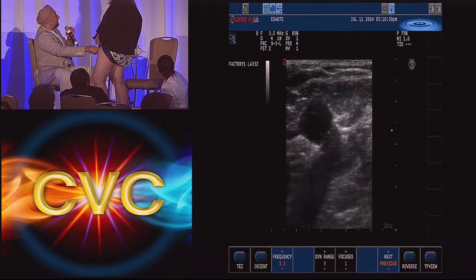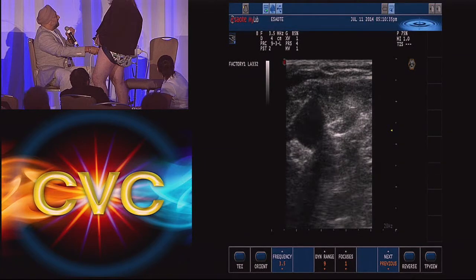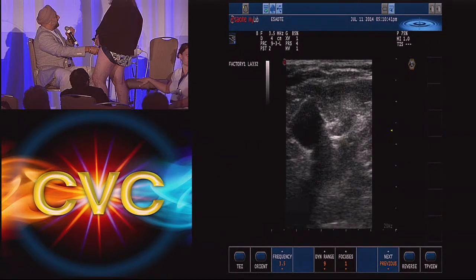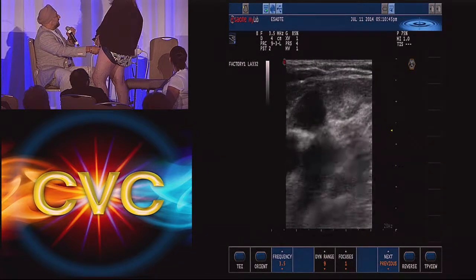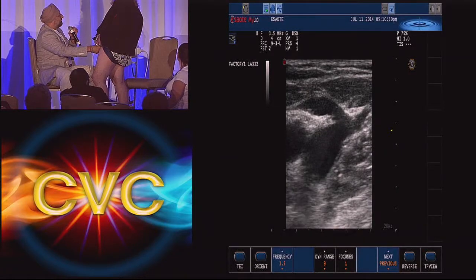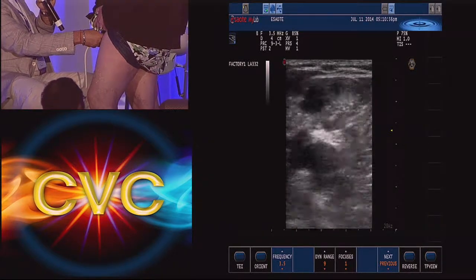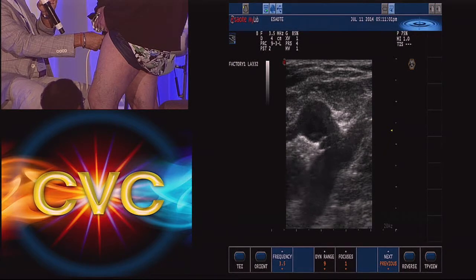Deep breath. Blow it out. See that valve flapping there? Do that a few more times, please. Do you see that valve flapping? Little white line flew by. And I'm compressing it. If I've compressed the vein, you watch that vein there? You see the valve? Spluttering. Now I'm compressing it so it looks small, but what happens when I release it? Yes, can you hit color now, please?